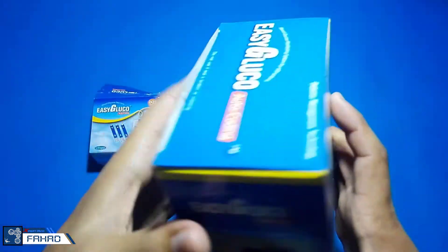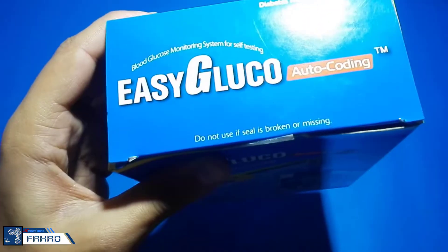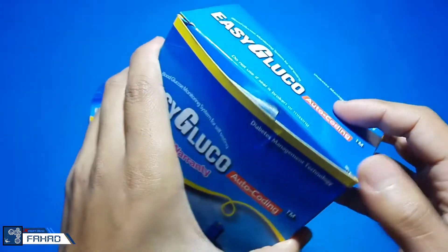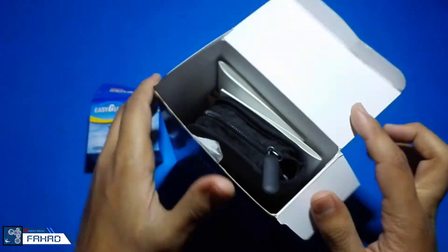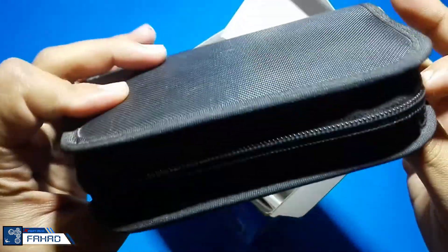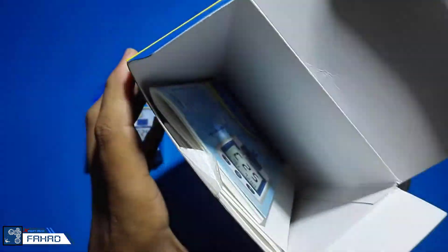So let's open it. Note that if the seal is broken or missing, don't open it. But I already moved the seal when I was checking the components. So let's look inside — there is a black pouch.